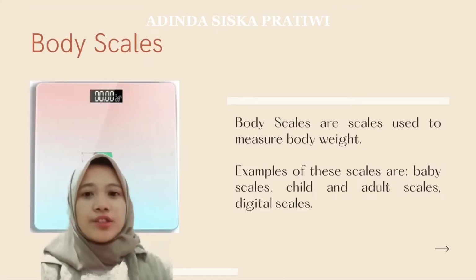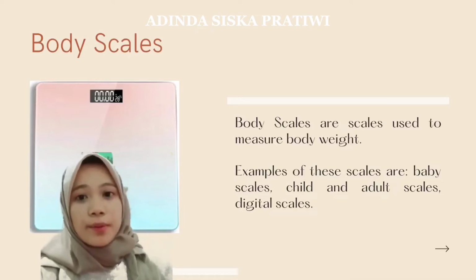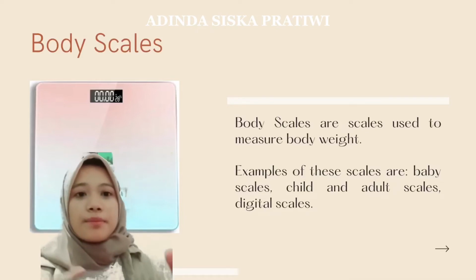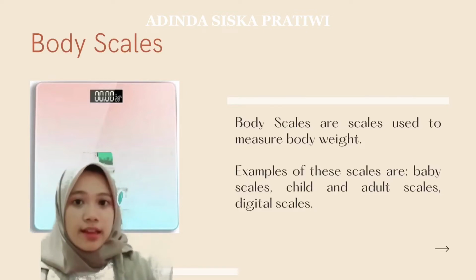Body scales are used to measure body weight. Examples of these scales are body scales, baby scales, child and adult scales, and digital scales.